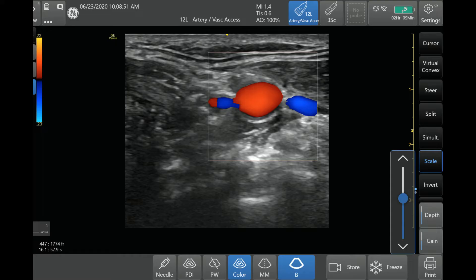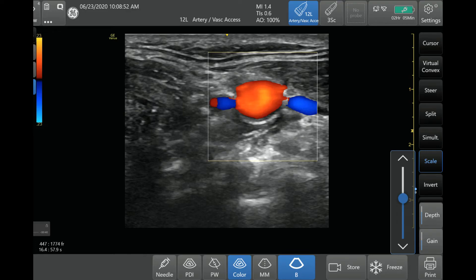The next thing you can do is adjust the scale. There's a scale button — all machines will have some type of scale button where you can adjust that. What this does is it affects how much speed the color Doppler is detecting. Here, this is 23 centimeters per second.